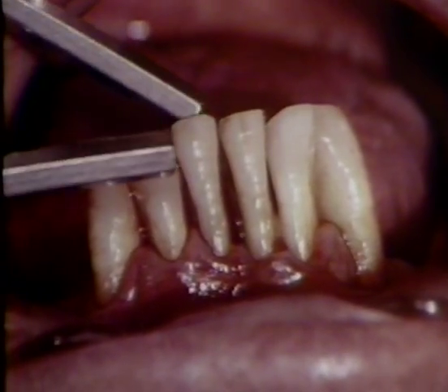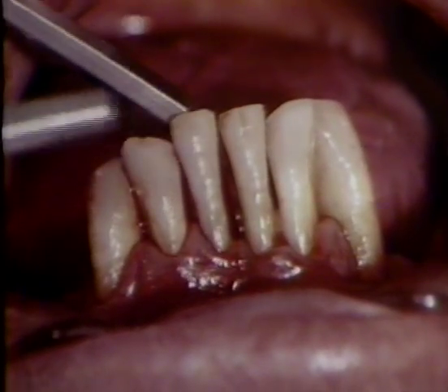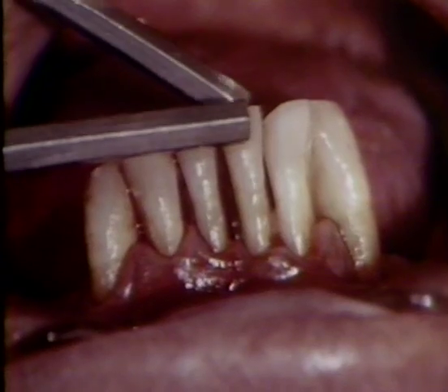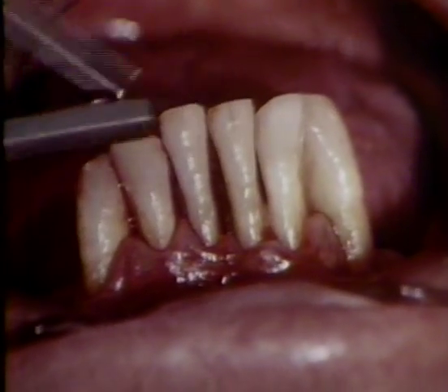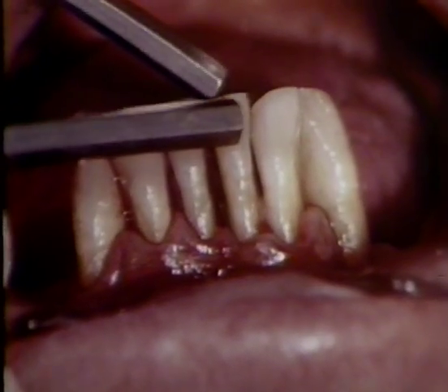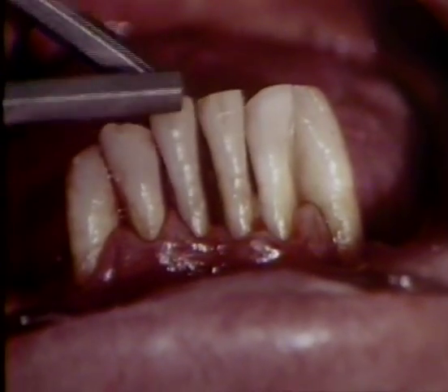Circumferential wiring is an effective procedure for stabilizing segments of loose teeth. Since this patient wants to retain some of these anterior teeth, it is necessary to stabilize the entire segment prior to initiating any periodontal therapy.